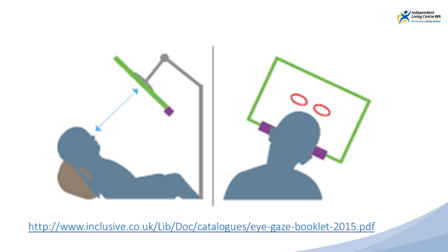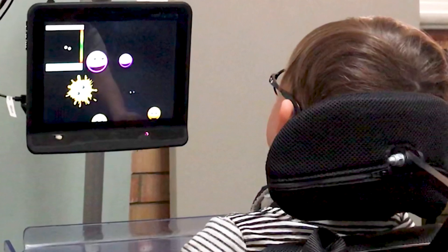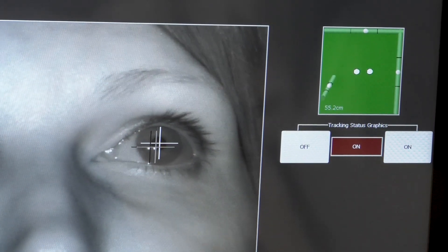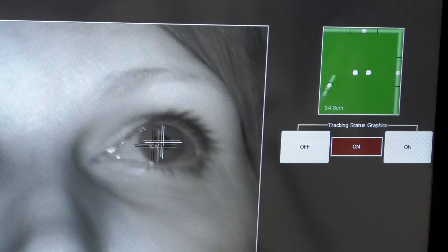A certain distance needs to be maintained between the student and the system. Each device will have its own recommendations, but this tends to be between 45 centimetres and 85 centimetres. The eye gaze system provides visual feedback on positioning as a guide to find the best spot. This can look a little different depending on the device.